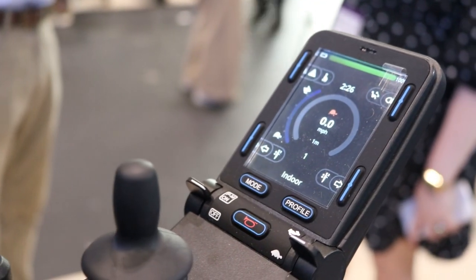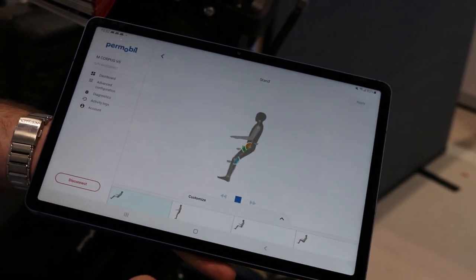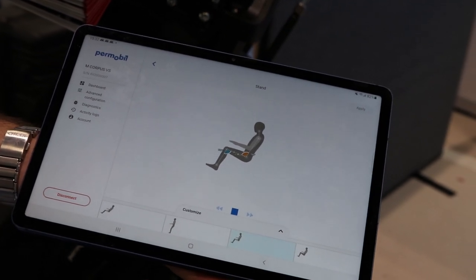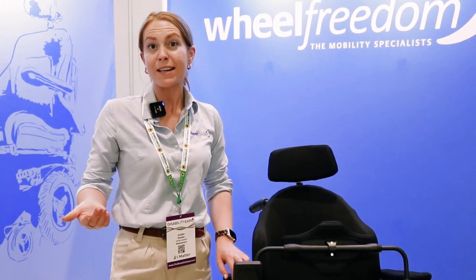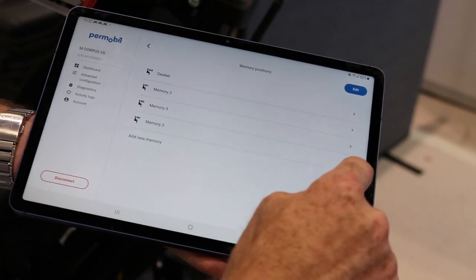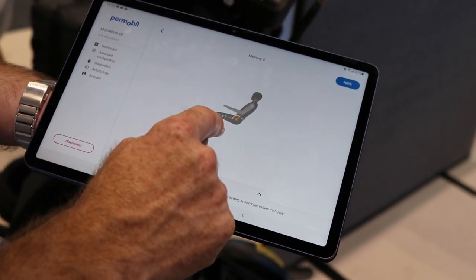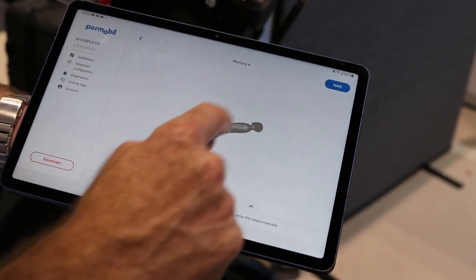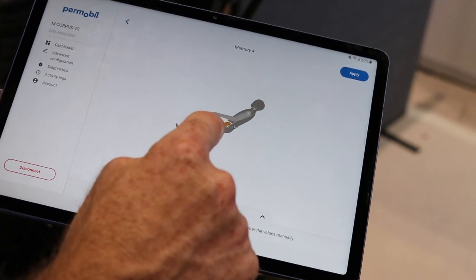Another feature on the joystick is memory positions. If you've got a particular position you'd use for personal care or maybe your desk position, you just tell your controller to go to memory three and the chair will automatically adjust to that position. Similar to cars where you can have multiple driver positions, you can have multiple memory positions here, so you're not having to cycle through the whole process.